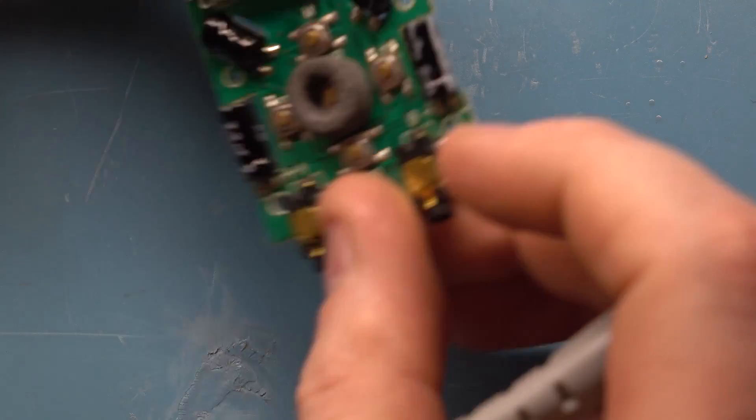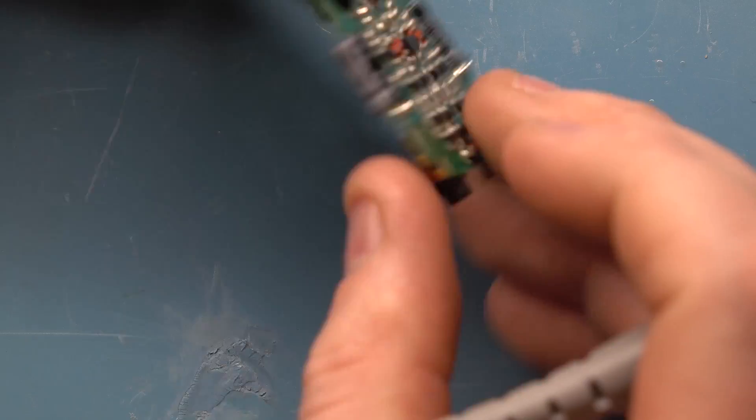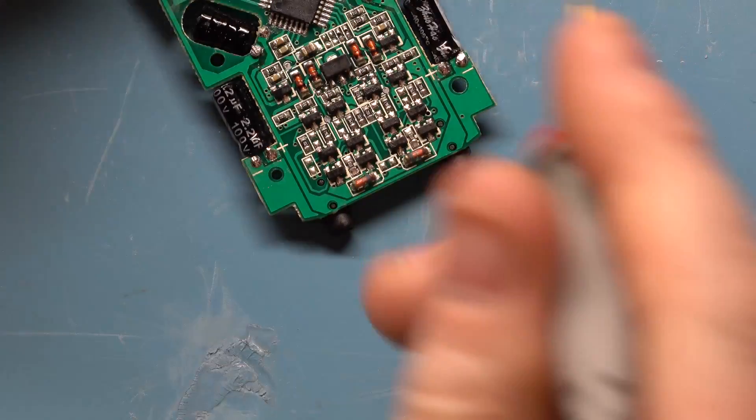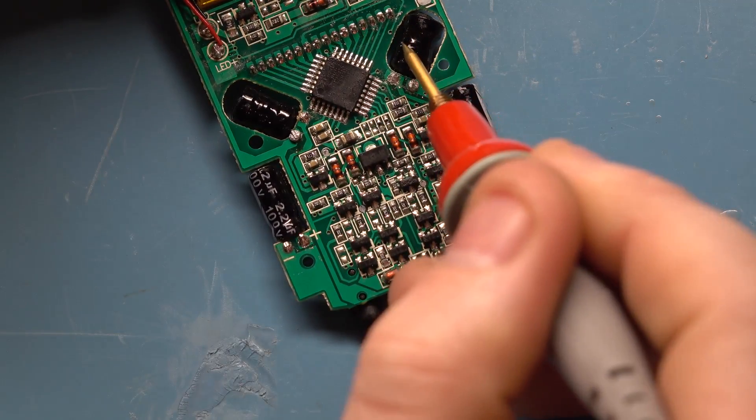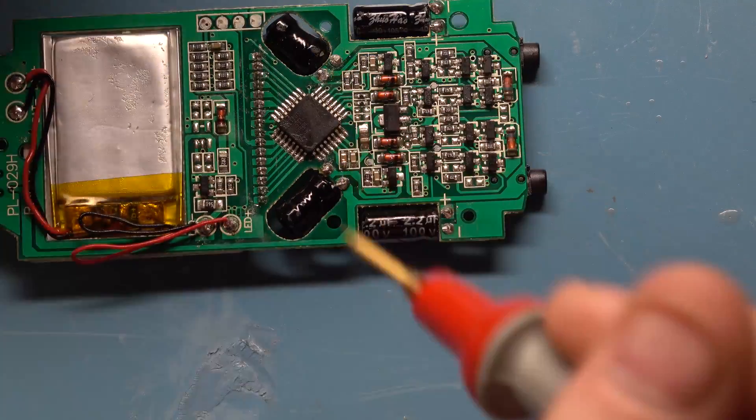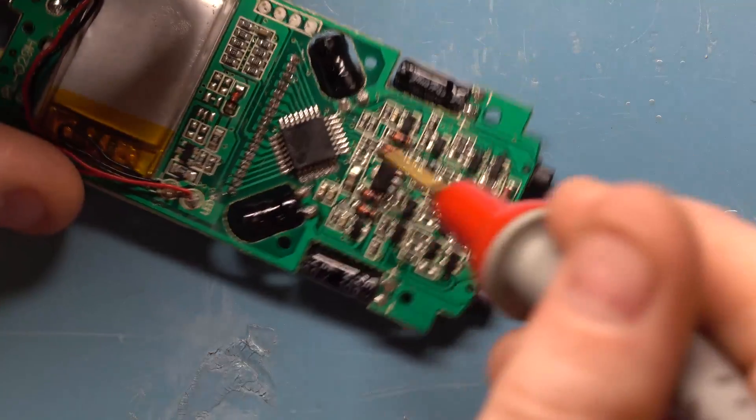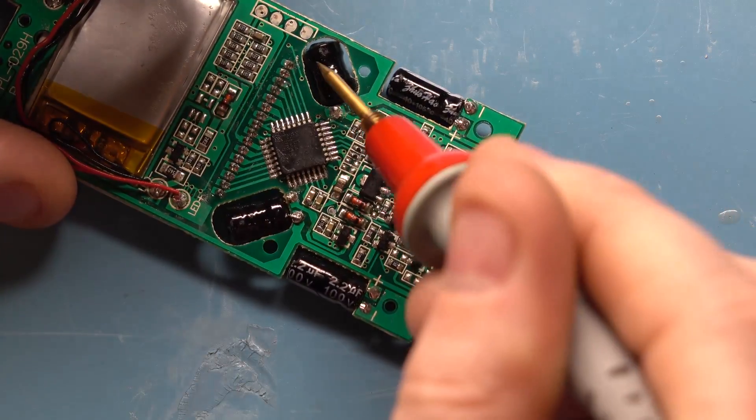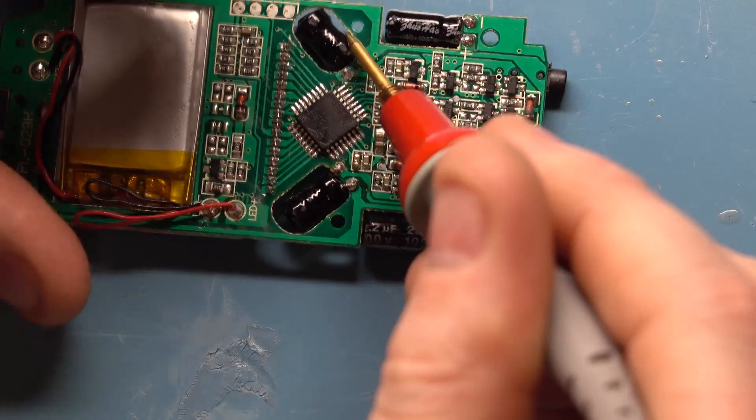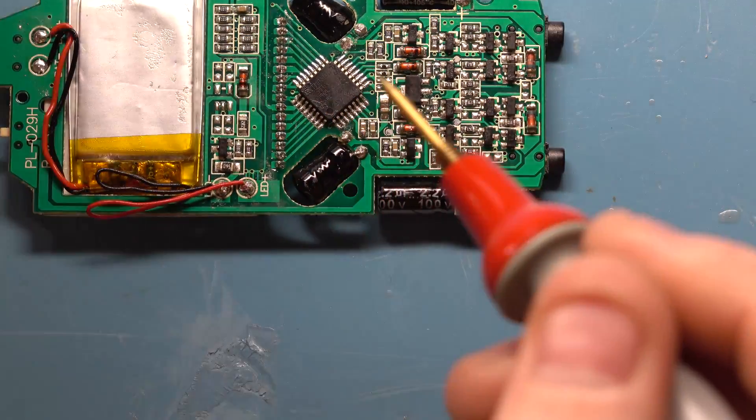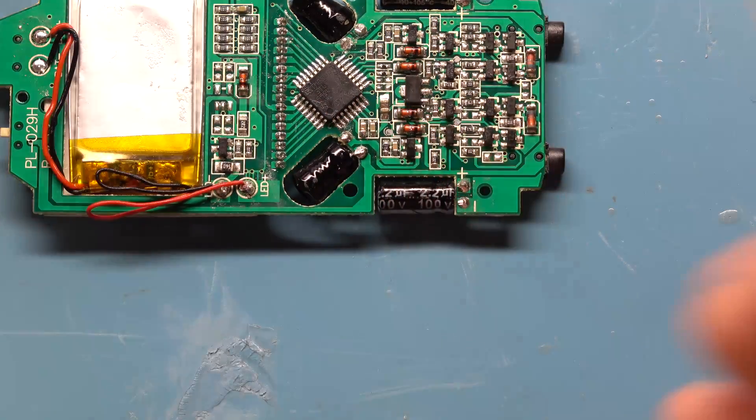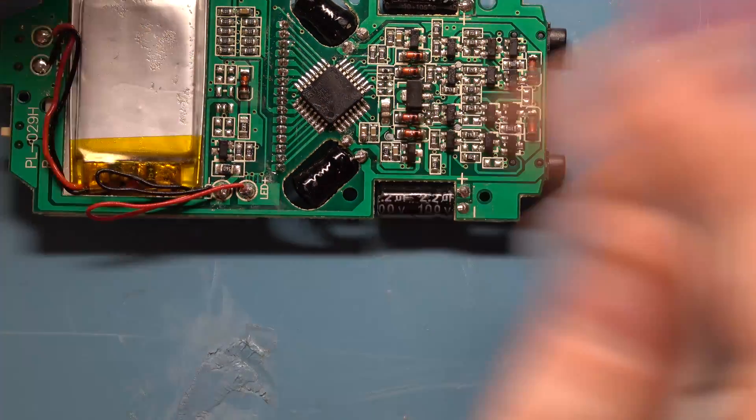These capacitors here are for storing that energy released from the inductors. And the way a boost converter works is you send current through an inductor and then all of a sudden you cut off the current flow.